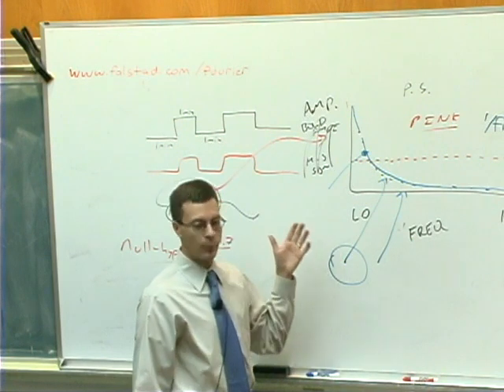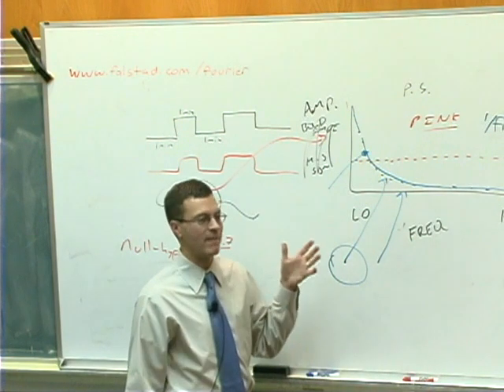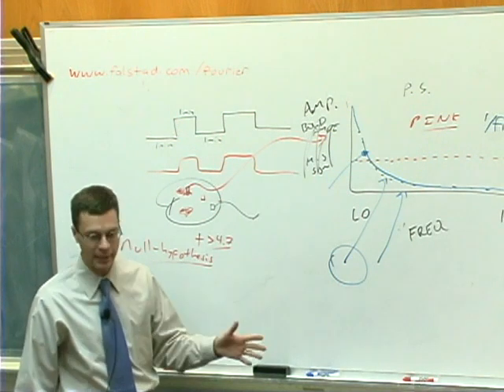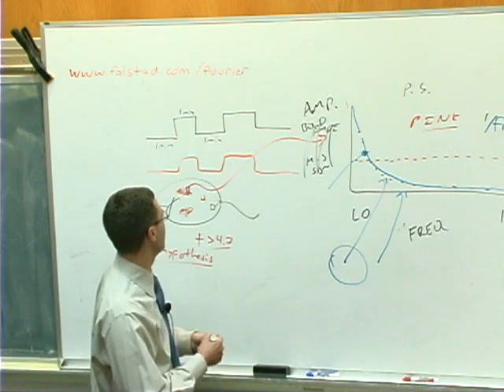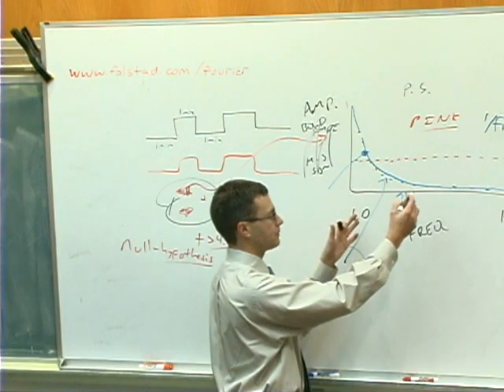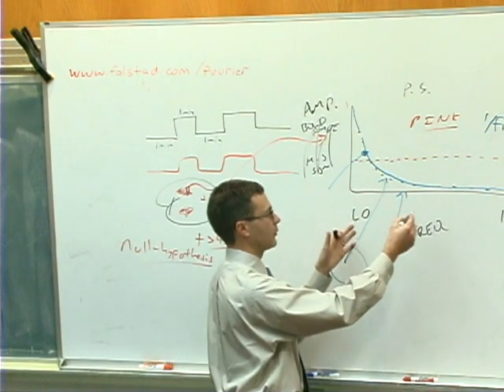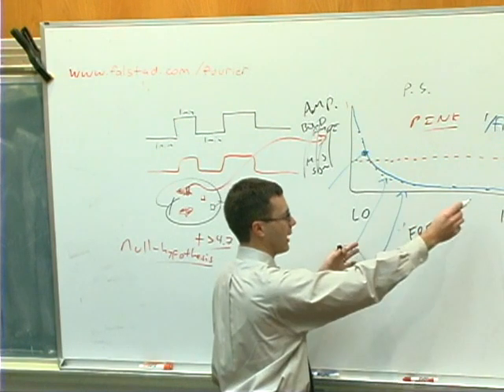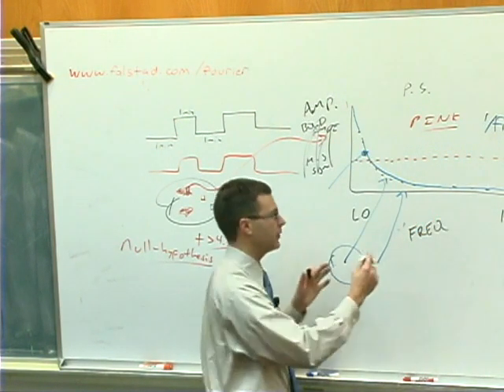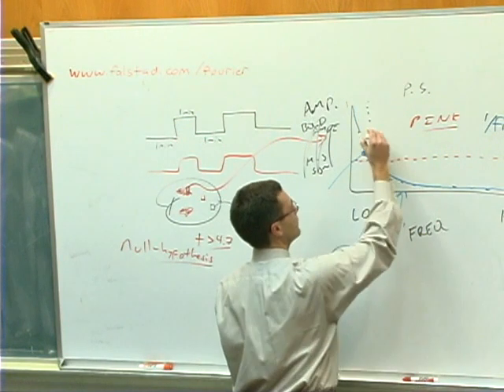So it's irritating to begin with. And if that weren't irritating enough, it is highly variable in its shape from voxel to voxel across the brain, particularly in its low frequency components. So if I plot the power spectrum, not all averaged together across all the voxels, but now show you not only the average power spectrum across the voxels but also its standard deviation as a function of frequency, it looks a little bit like this.